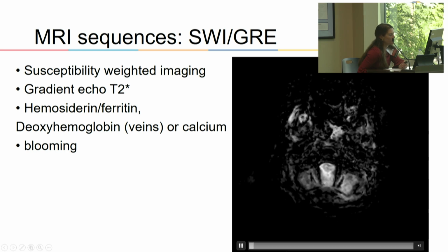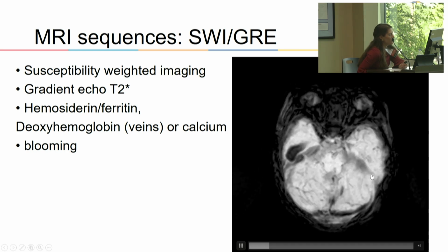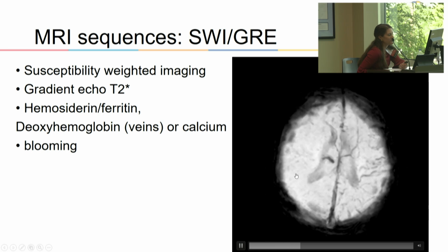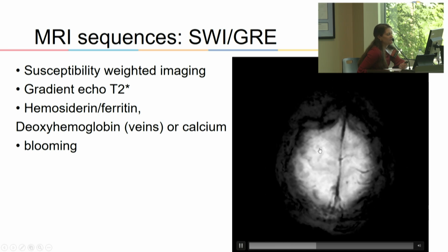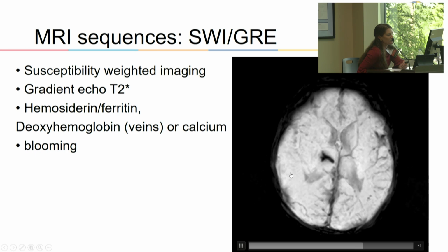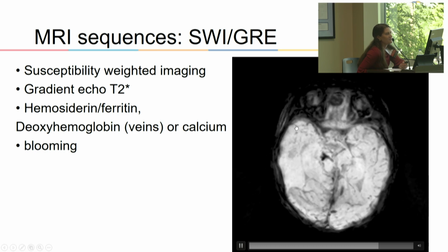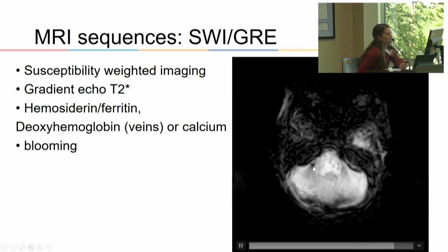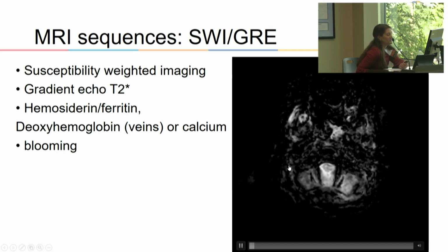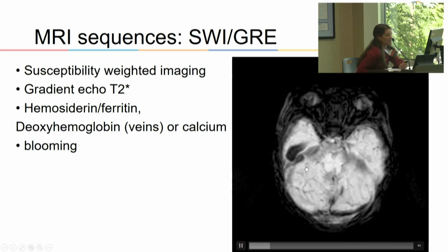And if you look also, you can see kind of a paucity of vessels on that right side. So imaging is also switched, if I didn't say that. So this is the left, this is the right side of the brain. So look at that paucity of vessels. This was a 17-day-old with HSV meningoencephalitis, and her right hemisphere was much more affected than her left. And so that paucity of vessels is indicative of that whole hemisphere being basically swollen.